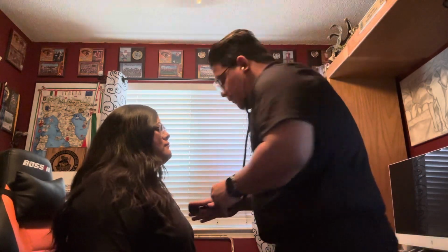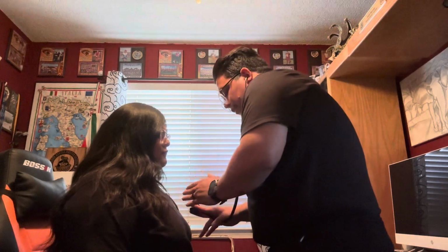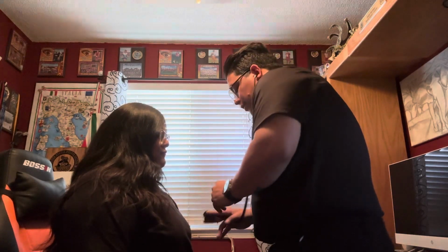Do you prefer me to move your breast up, or do you want to go ahead and do it yourself? You can do it. Okay, perfect. So what I'll do is going to be kind of like mid. So from the tricuspid, you would literally just move a little bit down and to the right from where we're facing.